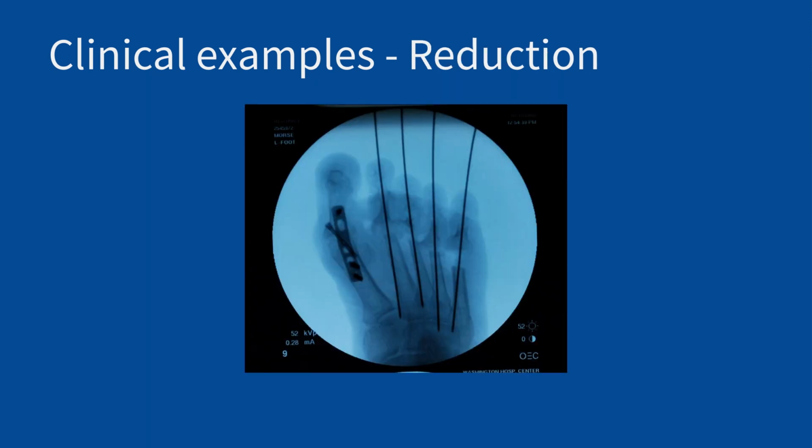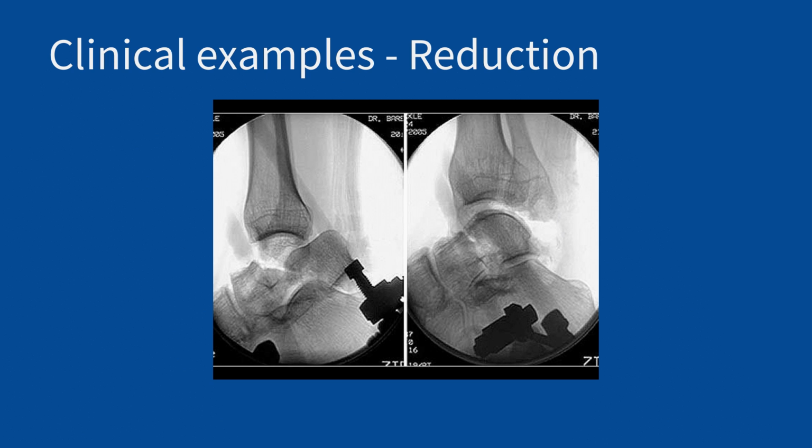Next, a nice example of fracture reduction, right? Again, this is surgical reduction. I don't know how frequently people still do closed reductions for fractures, since it seems like the majority are treated surgically if they are displaced, at least in adults. But certainly people used to do a lot of closed fracture reduction under live fluoroscopy, which does help in making sure you get appropriate alignment.